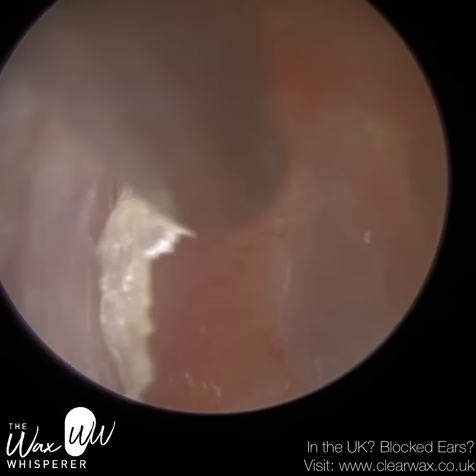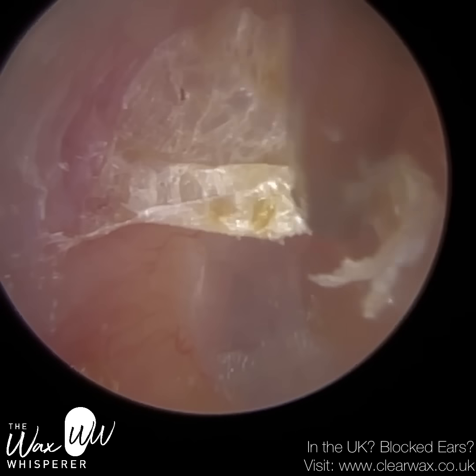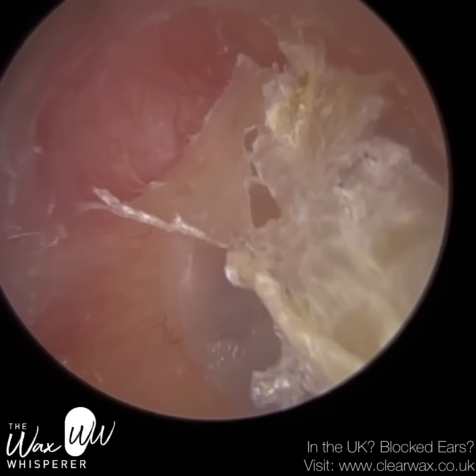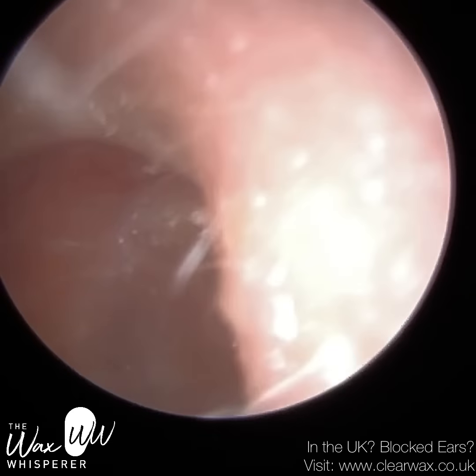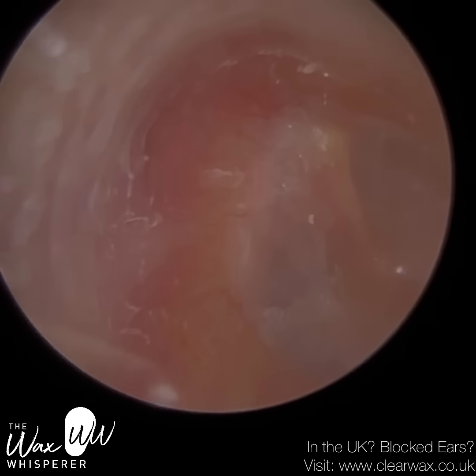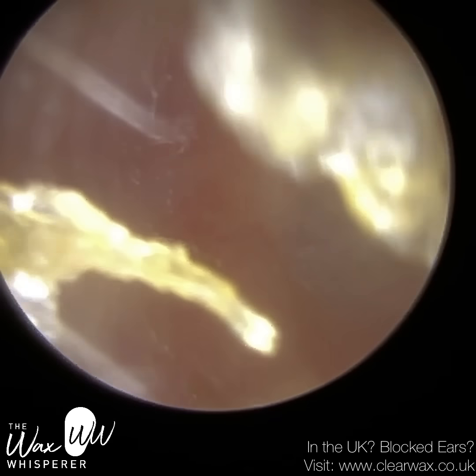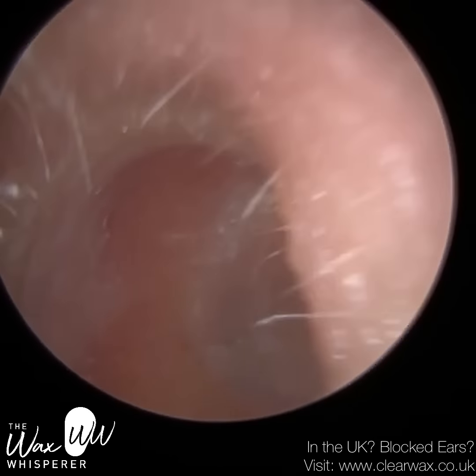These are not procedures I would normally attempt with children, as I said, because it is always a bit more tricky, but this patient's been coming for so many years now, and they're so comfortable and so still, it's great. It allows me to help them by removing all of this dead skin, which a few years ago I probably wouldn't have been able to do with this patient. So there's a bit just past the first bend, hiding away, I'm just going to peel that away. Just block the suction probe there.